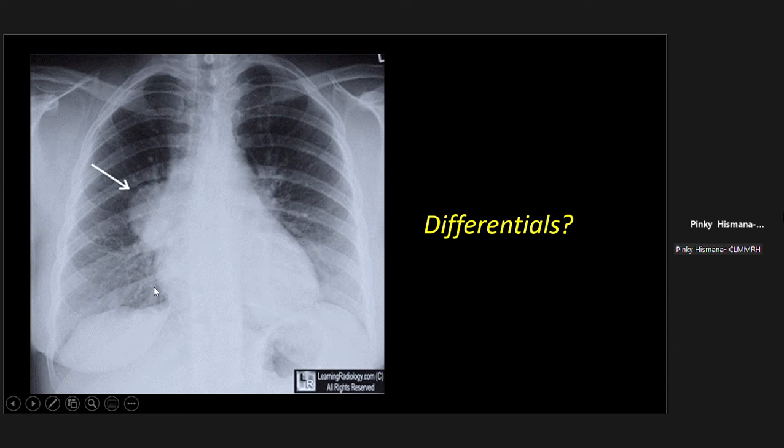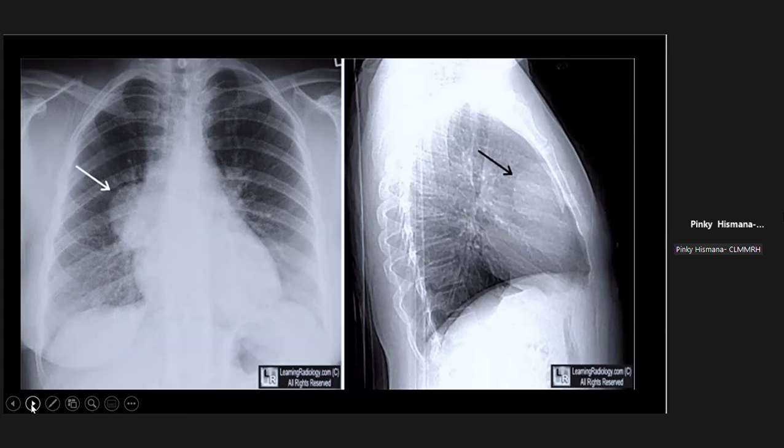if they cannot give you a confirmative diagnosis given certain pathologies presented with X-ray, because it's really difficult for them to localize and identify the lesions. So that's why usually we give you differentials or various considerations of what the pathology is. I don't know if you get what I mean, but later in the future, I hope you remember what I'm trying to say right now.